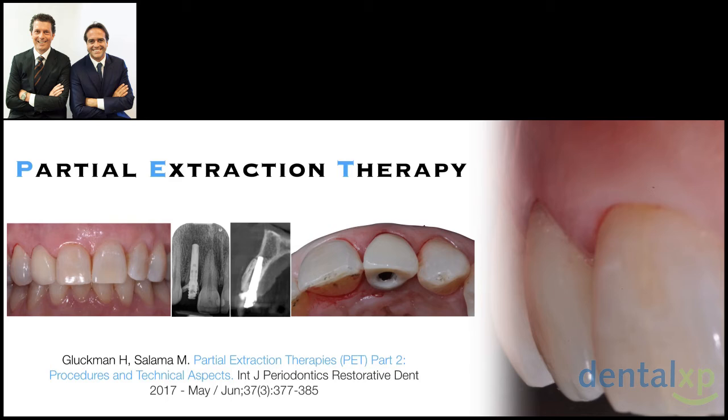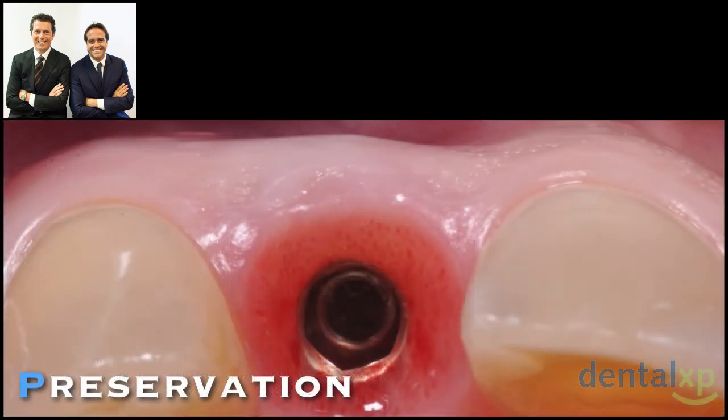So remember, the comfort of the patient also during the treatment phases, and what we said at the beginning: these approaches, this immediate implant placement in the aesthetic zone with immediate provisionalization, are able to preserve the soft tissue around, and the hard tissue is preserved by the technique that we are choosing. Look at the root profile that we were able to obtain and maintain in this type 1 case. Type 1, the target, our goal, the objective of the therapy is to preserve what we have, and that was the goal that was fulfilled also in this case.